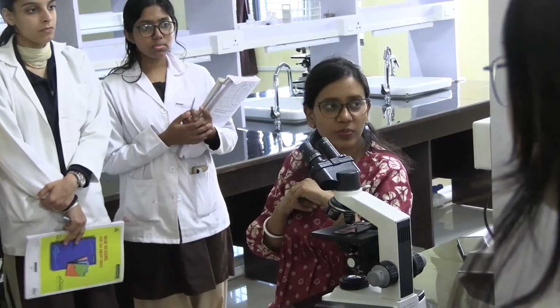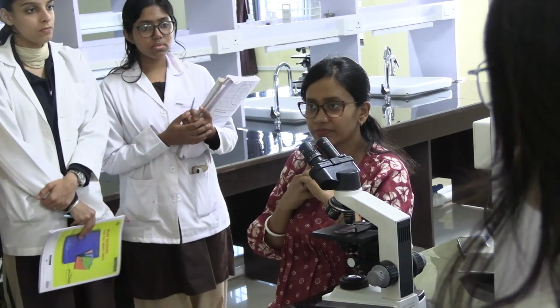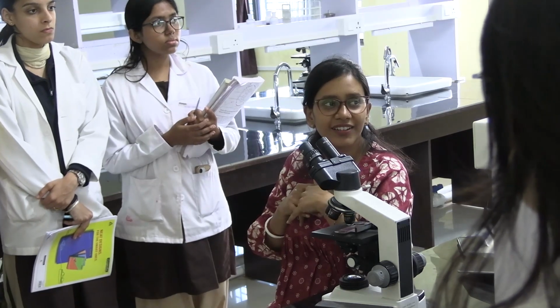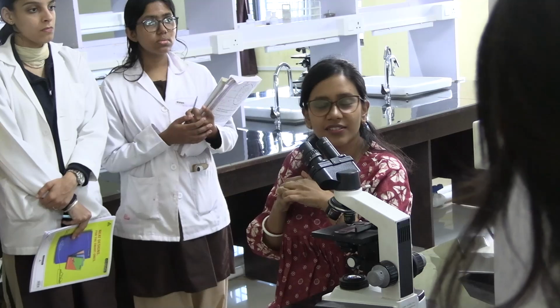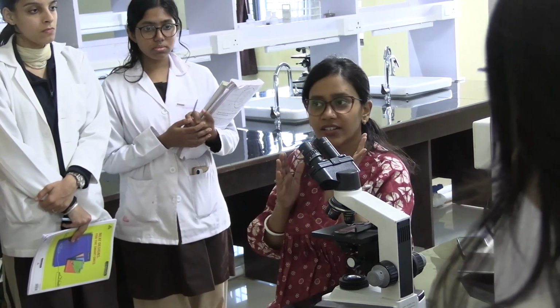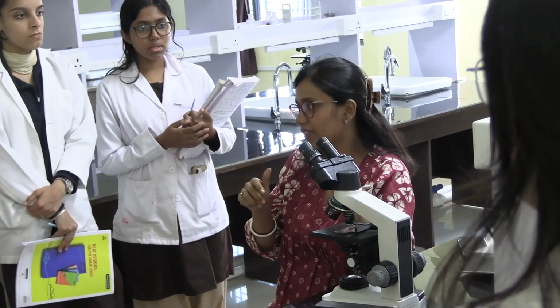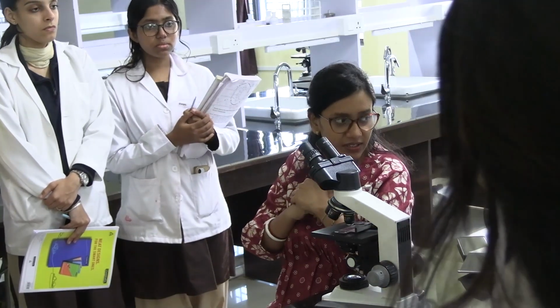And carcinoma is very broad, right? Then adenocarcinoma, papillary carcinoma of thyroid, very good. Then breast, okay. So these are all malignant tumors, and where are they arising from? Epithelial. Okay. Now, what about the malignant lesions arising from the mesenchymal component?